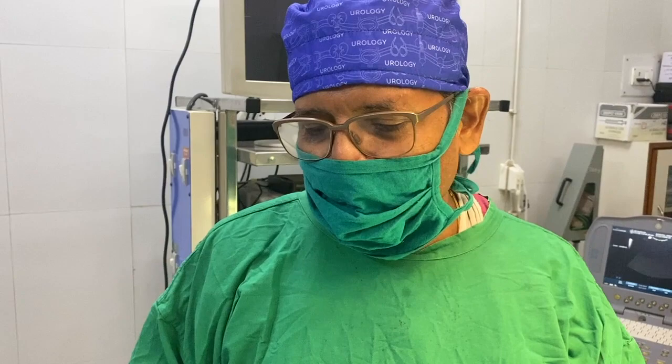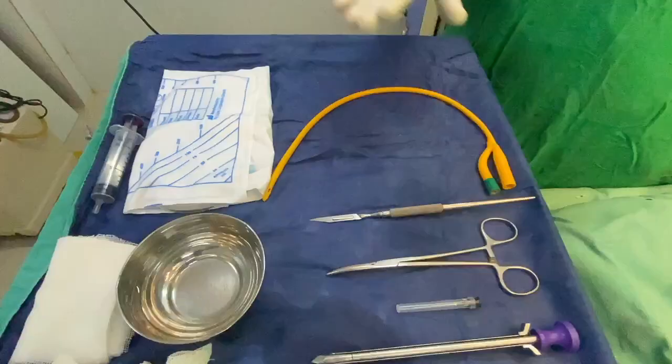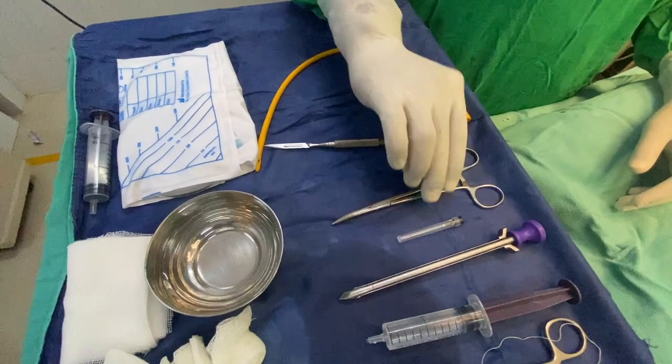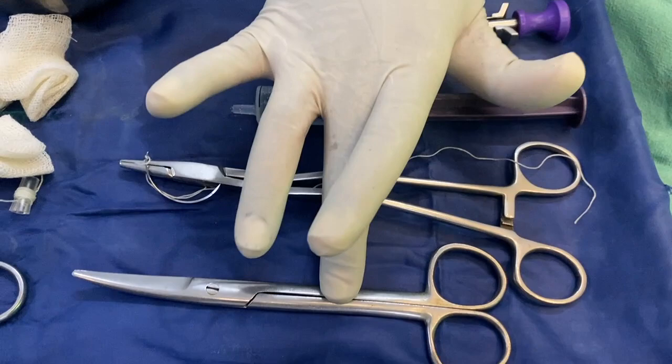We will now see the standard trolley for suprapubic cystostomy. Not many instruments are required. This is the trolley: a number 11 blade on a number 7 handle, one hemostat, one needle for aspirating and confirmation of the bladder, one trocar syringe for inflating the balloon, and suture with needle forceps and scissors.